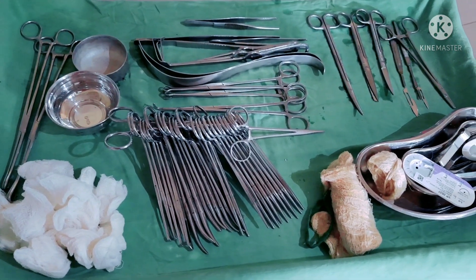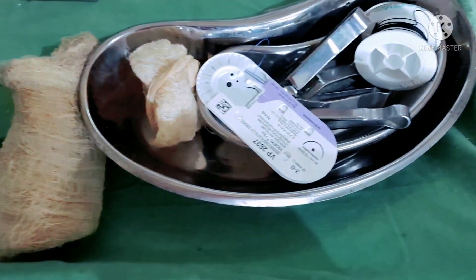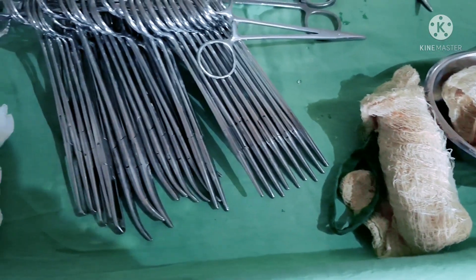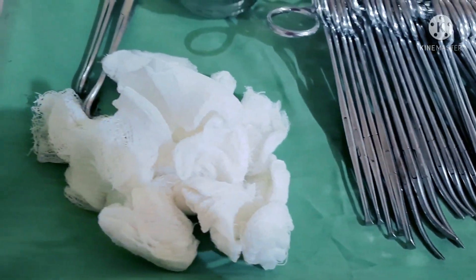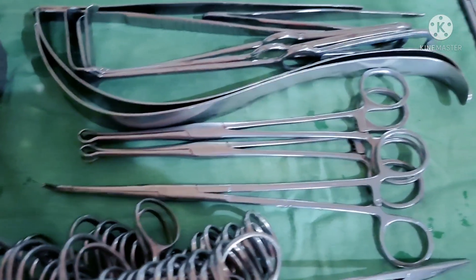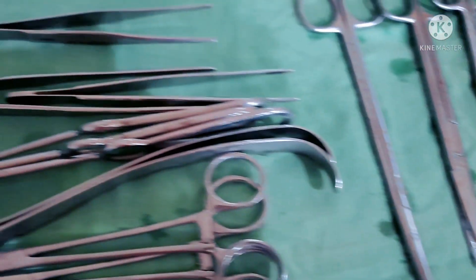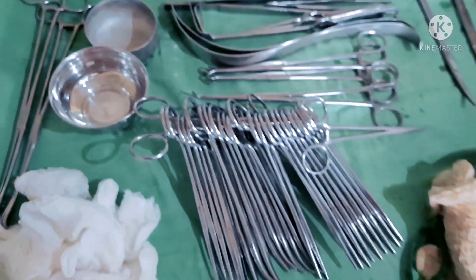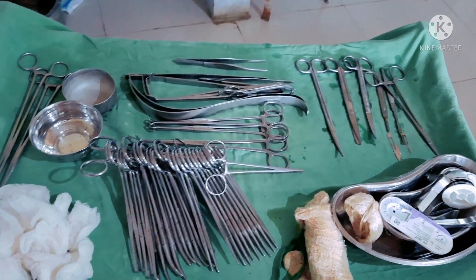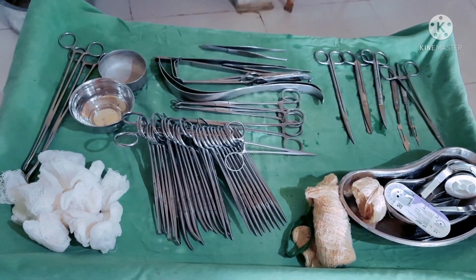Today I have set up an open appendectomy operation trolley as requested by students who come into OT for learning experiences, to input more knowledge regarding the instruments required for open appendectomy. All instruments and articles used for the operation must be properly sterilized prior to the operation to prevent infection. In this video I did not include the towels — five towels are required. My trolley is not a sterile trolley since I am using it for a learning purpose.